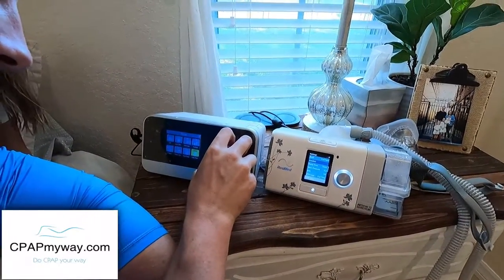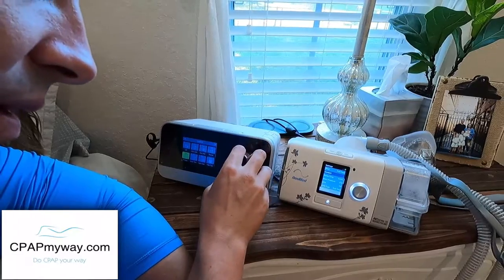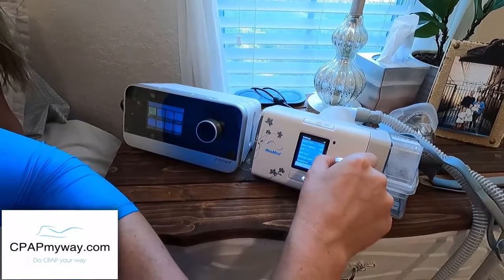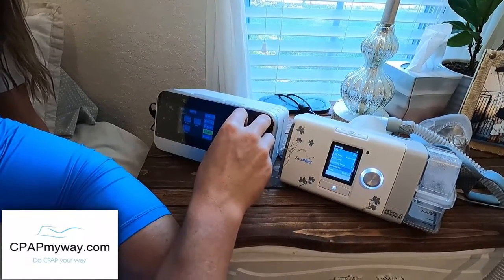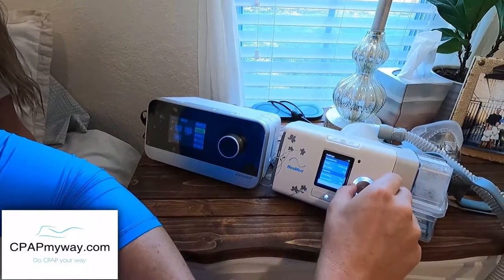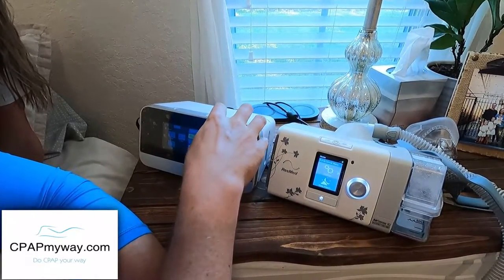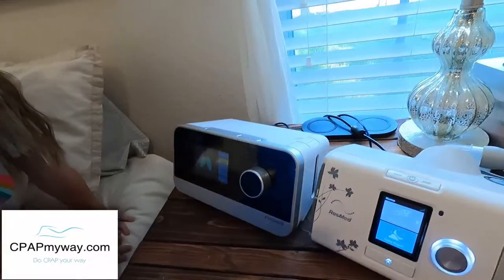A 5 minute ramp, starting at 4. EPR is 3, so we'll put it as a 3 in here as well. Humidity is set at a manual 6 on here, so we will do the same in here. And everything else is going to be pretty similar. All right, so back into the regular menus here, and we will see how this thing goes.